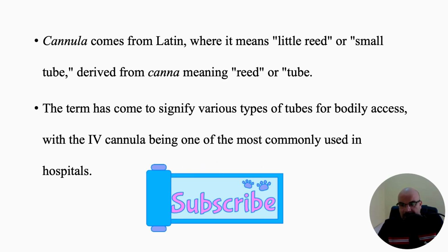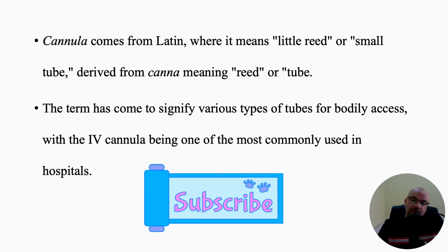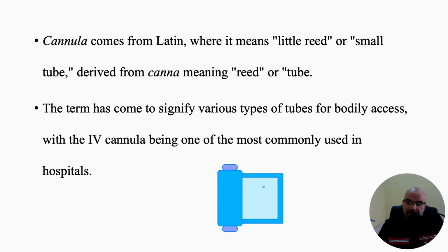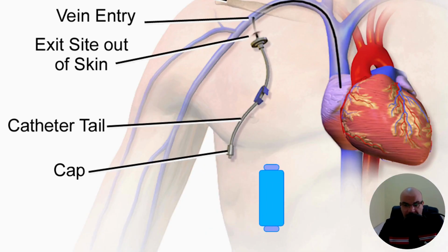It is usually used in healthcare to refer to the peripheral IV line. So we say IV cannula.